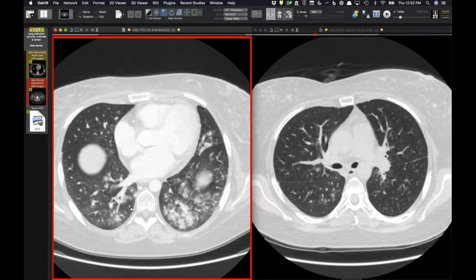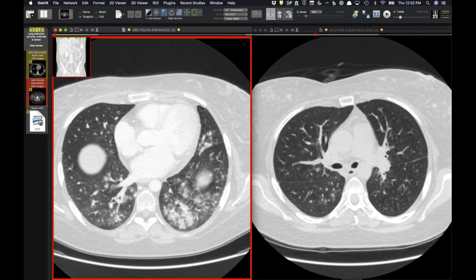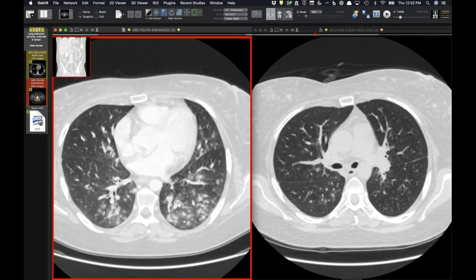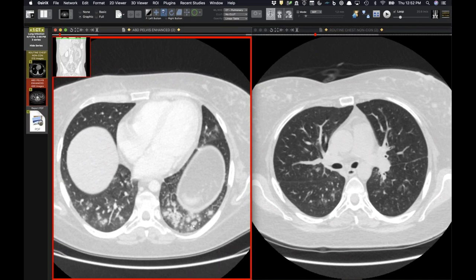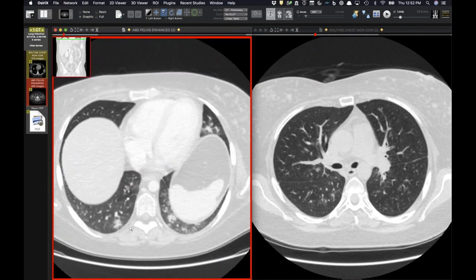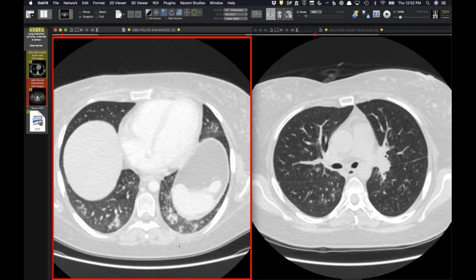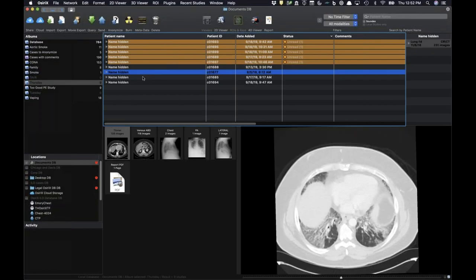This just shows kind of how it evolved. This is 4 days later on an abdomen and pelvis CT, so it doesn't go up any further. It just shows how these become more coalescent into these lobular areas of consolidation. Right. Mm-hmm. So just a pretty case of centrilobular nodules and a bronchiolitis from infection. Yeah. All right, let's see.